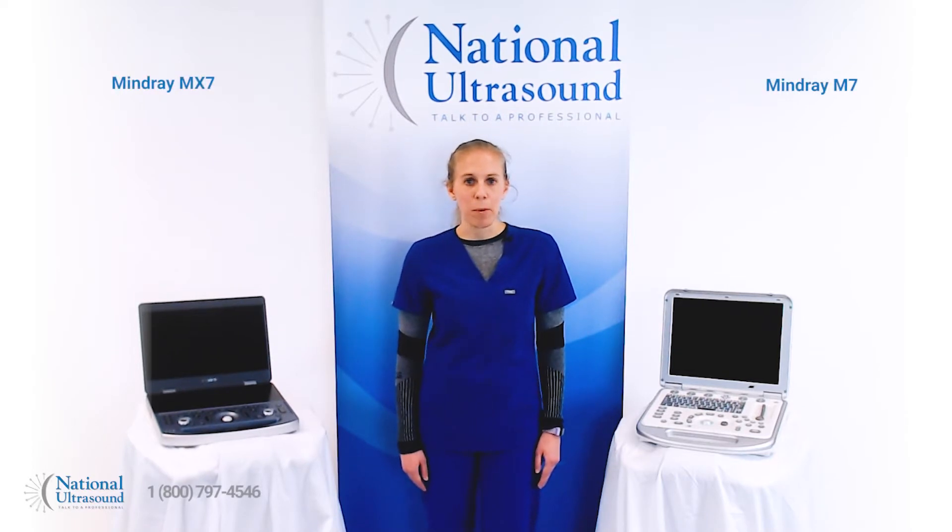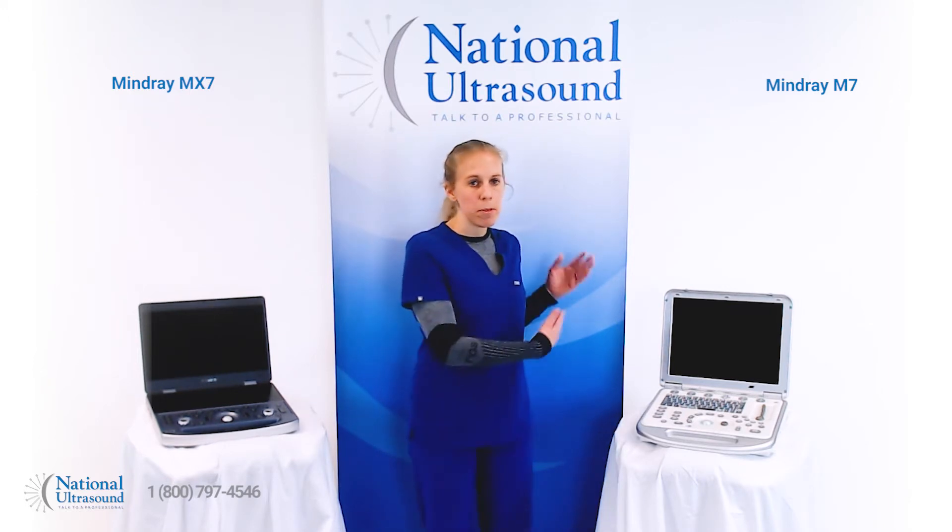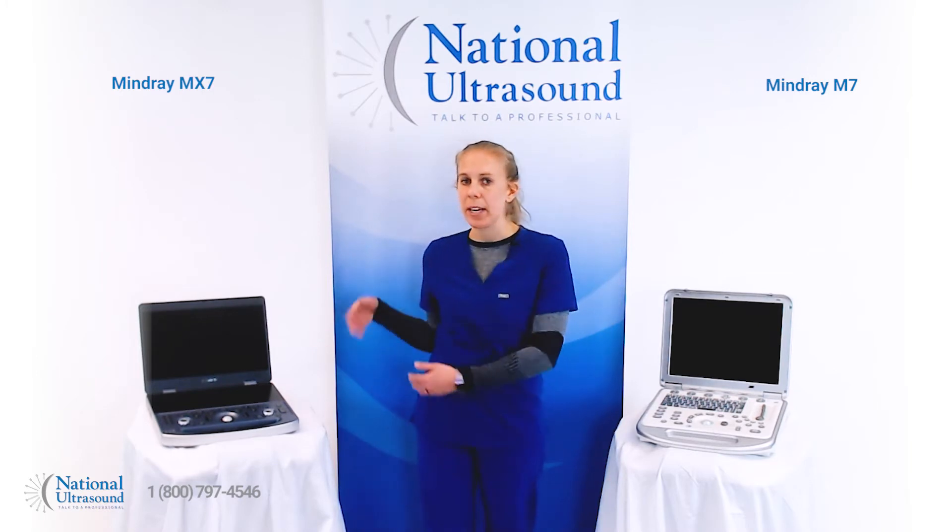Hi, my name is Chelsea and I'm a registered cardiovascular sonographer with seven years of experience. Today I'm at National Ultrasound comparing the MindRay M7 with the brand new MindRay MX7.